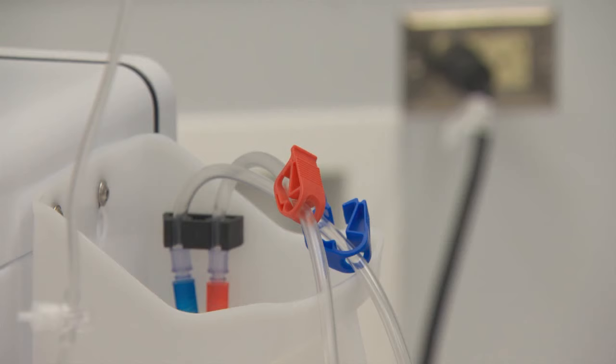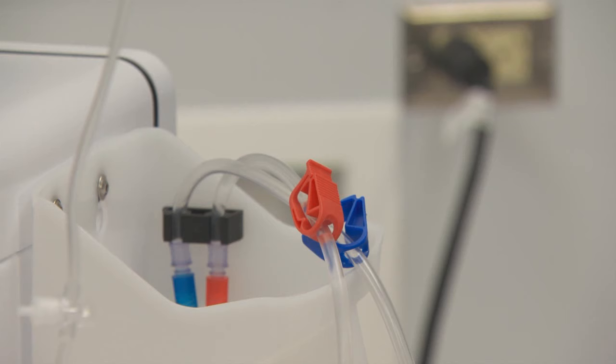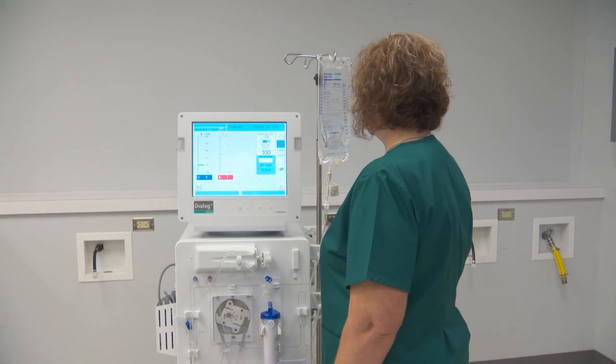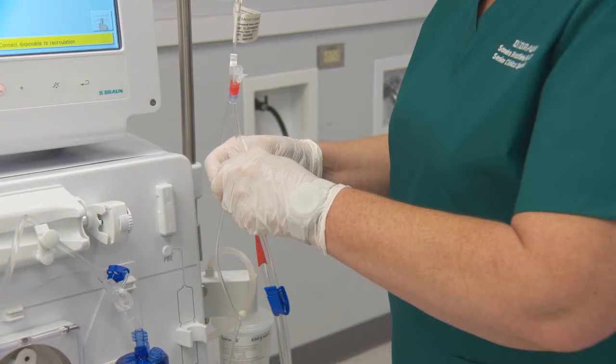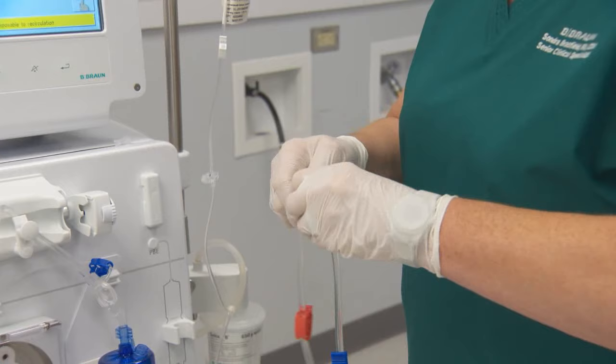Unclamp the large red clamp to allow the arterial line to prime by gravity, then clamp the large red clamp near the patient end of the line. Increase the blood pump speed to the appropriate priming rate. The blood pump will stop automatically once the prescribed volume has been primed through the system, and the message 'Connect Disposable to Recirculation' will appear. Connect the arterial and venous patient ends of the blood tubing and unclamp.